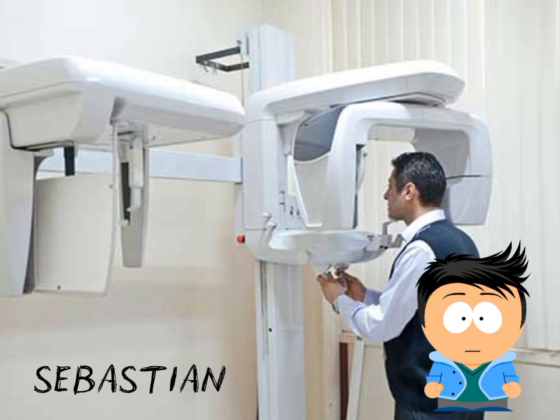Applications are identifying impacted teeth, and planning implants. Safety measures are lead aprons and non-abrasive cleaning. Portable units are battery powered.